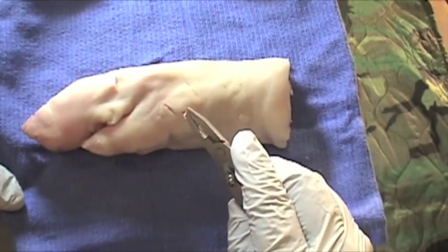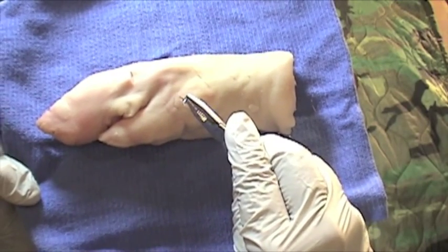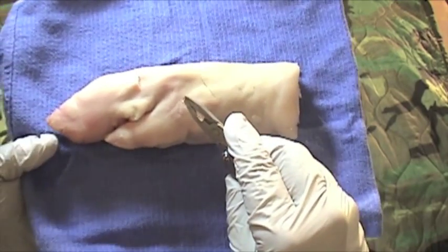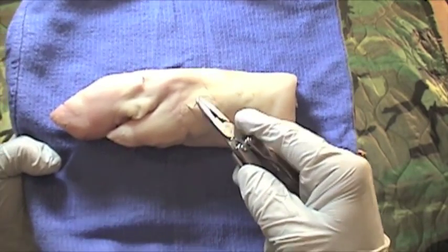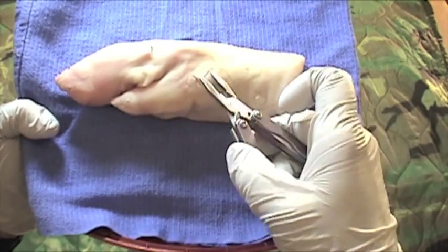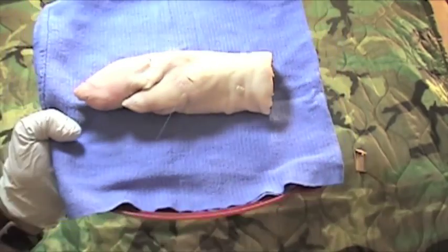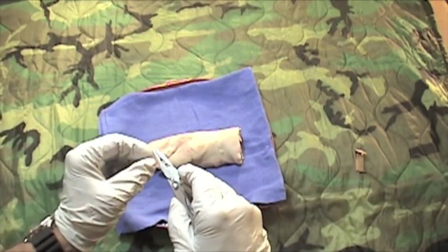You want to enter the skin about a couple of millimeters behind the wound edge, drive the needle in, and out through the wound. We're going to do this in two passes. Later on, with some experience, people learn to do this in one sweep.